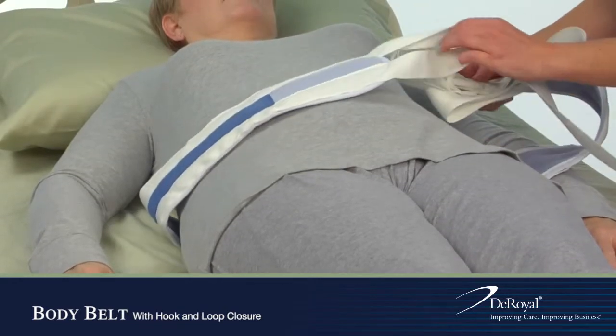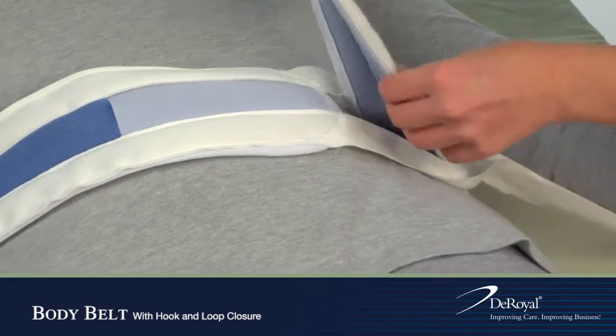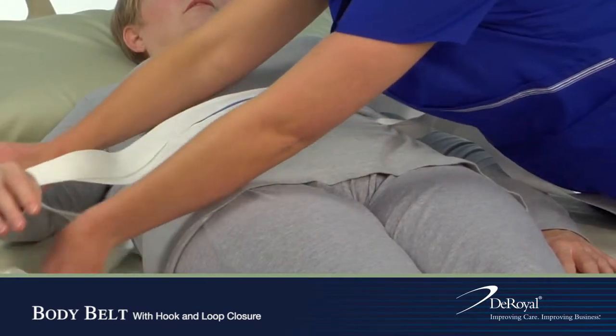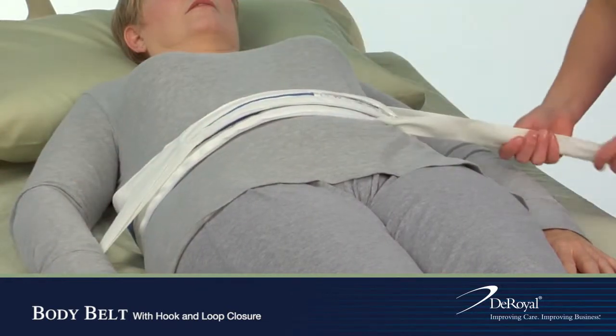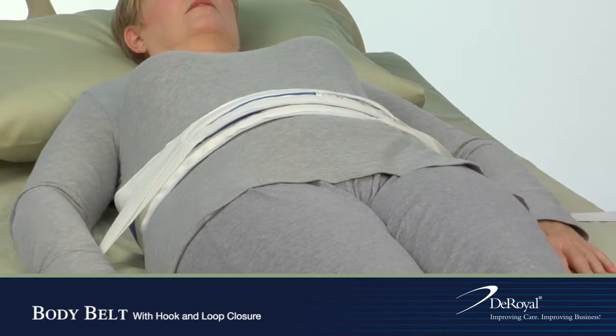Feed the narrow strap through the V-slot on the opposite strap in front of the patient. Secure straps to the bed.